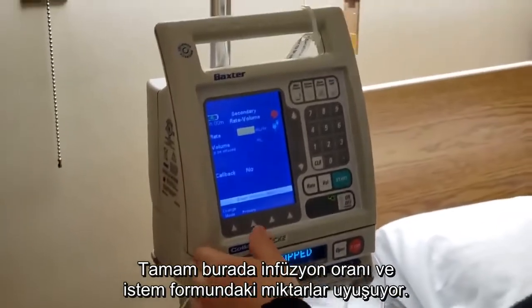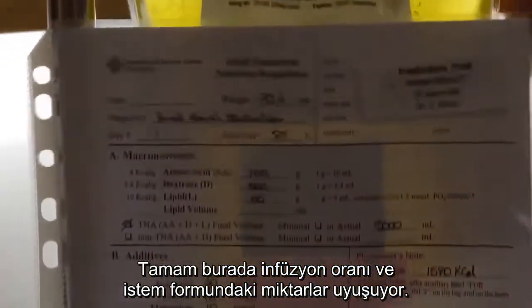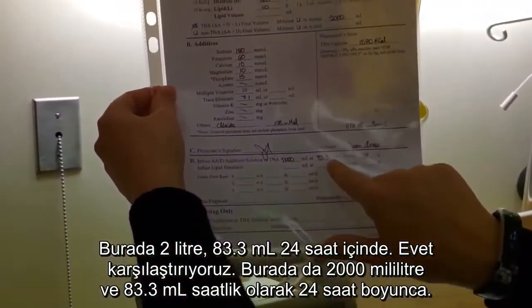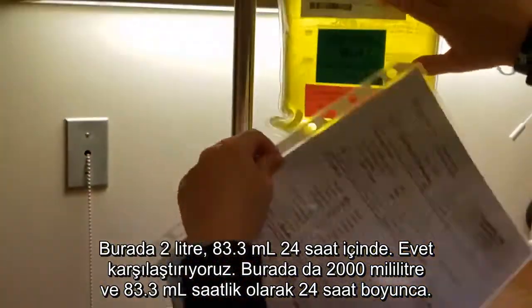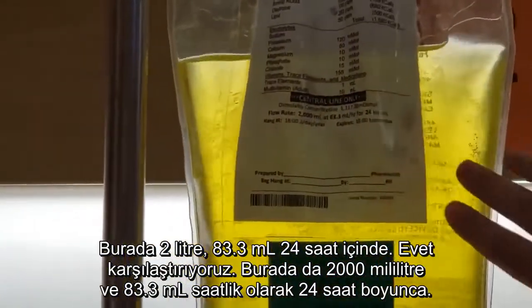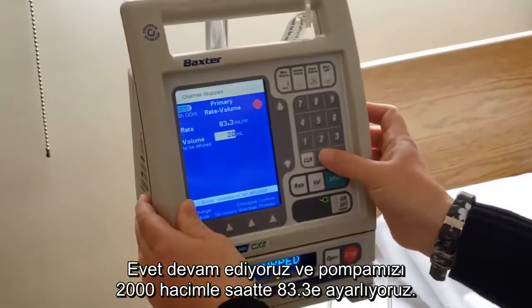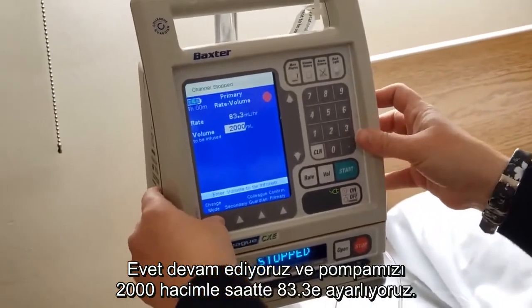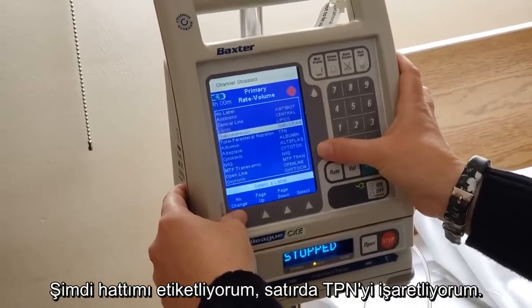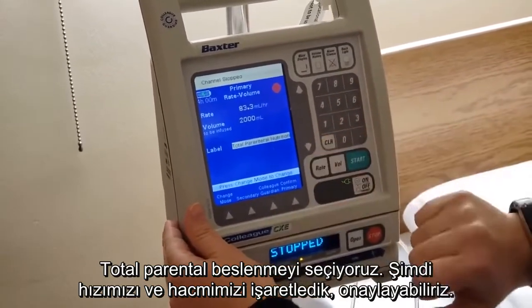Now I'm going to clamp this one and run my line. Open this roller clamp. Up here we have our infusion rate that will match our requisition. Two liters, 83.3 mLs over 24 hours — and we compare that here: 2000 milliliters, 83.3 mLs per hour over 24 hours. We're going to go ahead and set our pump: 83.3 per hour with a volume of 2000. Now I'm going to label my line with TPN — total parenteral nutrition, TPN select. We've got our correct rate and volume and our line is labeled.